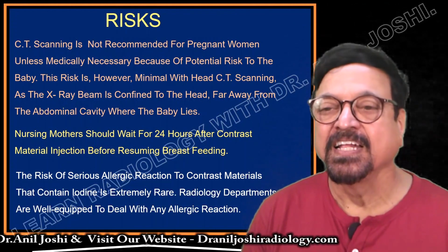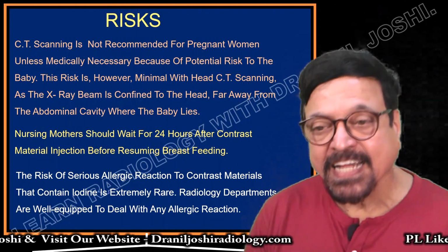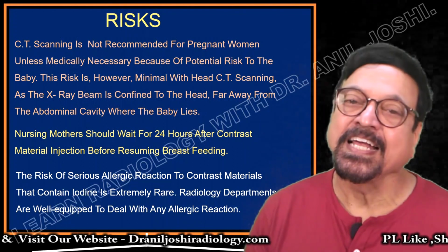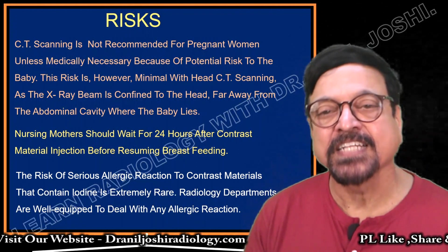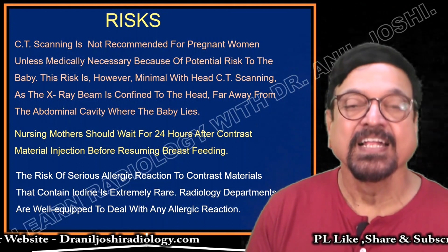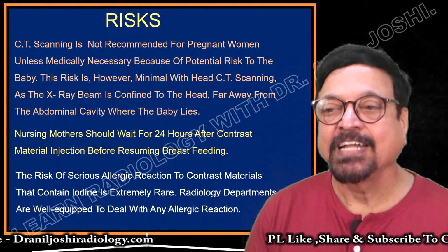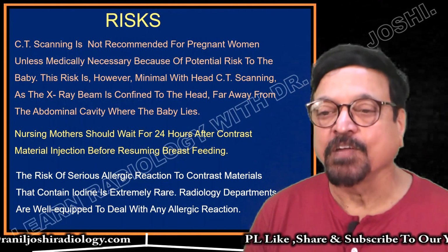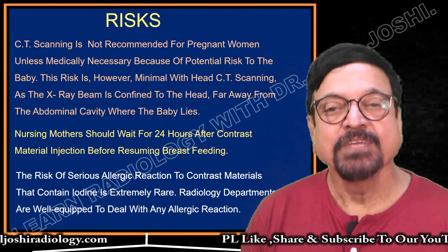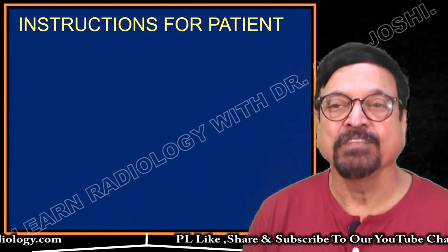It is very minimal. The risk of serious allergic reaction to contrast media that contain iodine is also extremely rare nowadays. With the introduction of non-ionic contrast, we are rarely getting reactions. However, we have to think of them, we have to take proper care, and all radiology departments are equipped to deal with these reactions. All the staff around know what to do and when to do it.